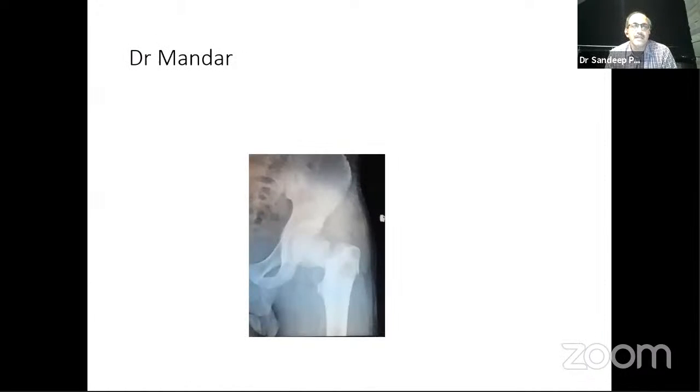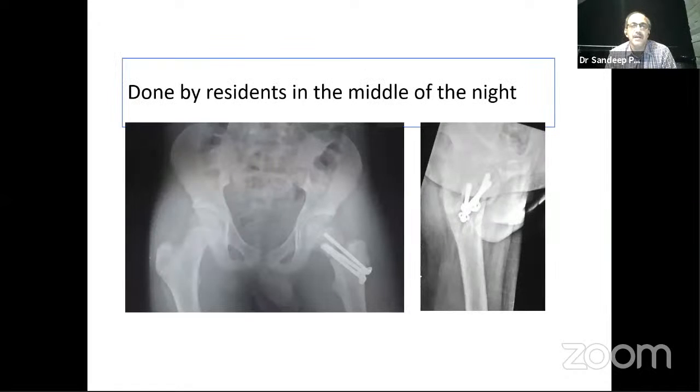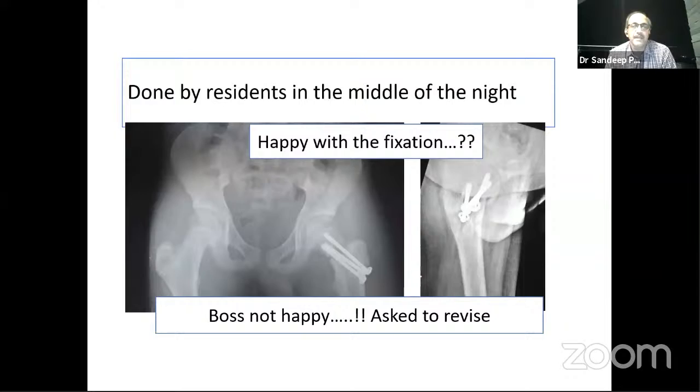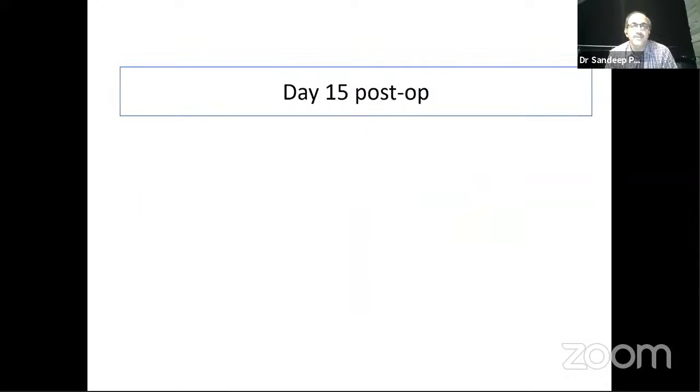This is a case, again, which Mandar had shared, a type 2 fracture done by residents in the middle of the night. And you can see that they have put short screws, not crossing the physis. The boss was not happy, so he revised it, and he went ahead and did screws which were long. So stability-wise, yes, good. But there is another problem that we have back home, and that is infection.